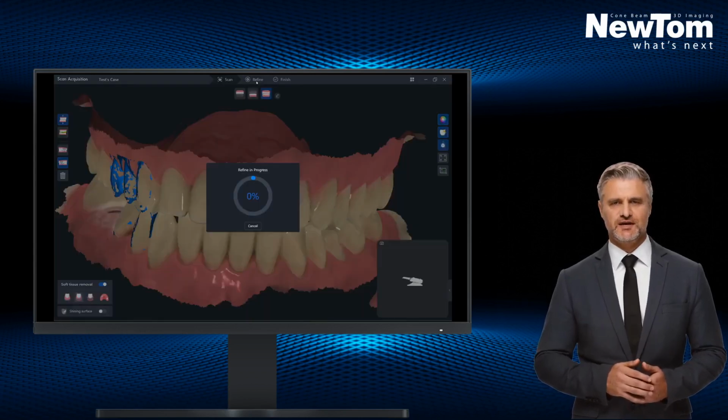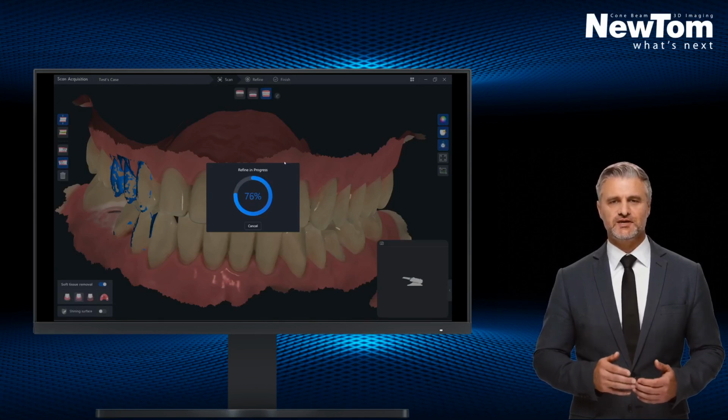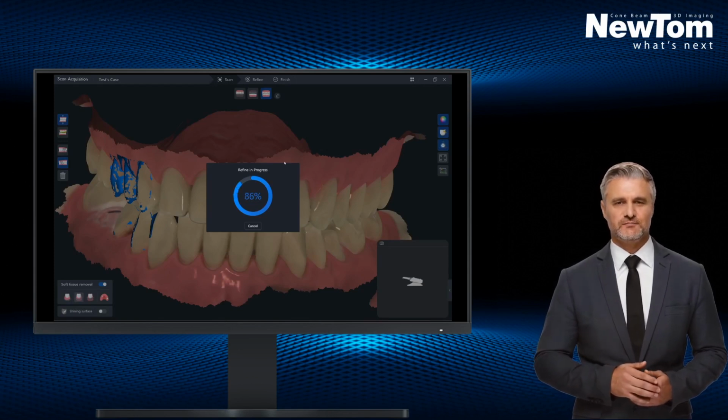It is recommended not to activate the device before it is in the oral cavity and before the patient is in closure. Otherwise, it is possible to record misaligned data. Once the acquisitions have been verified, we can proceed with the finalization of the model.